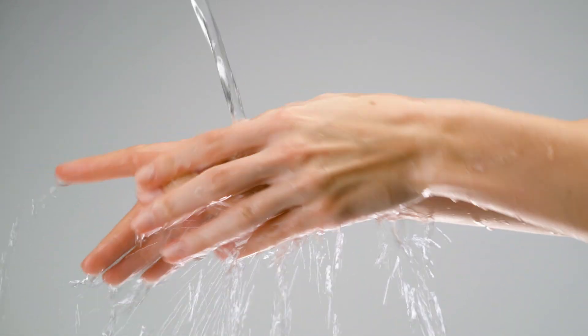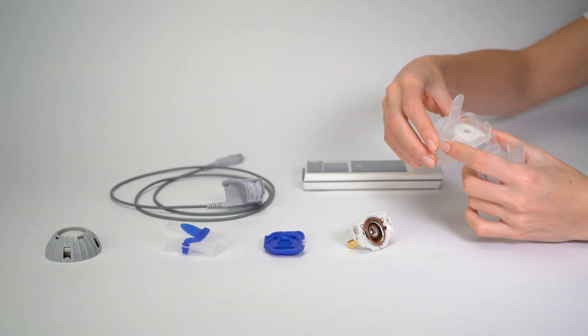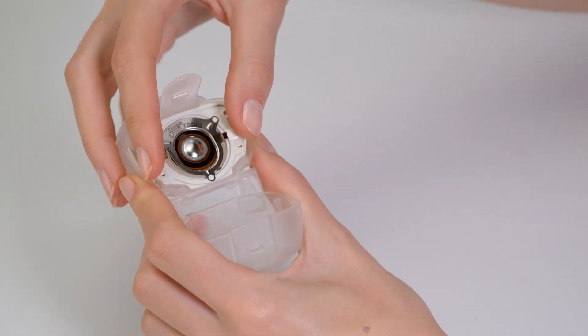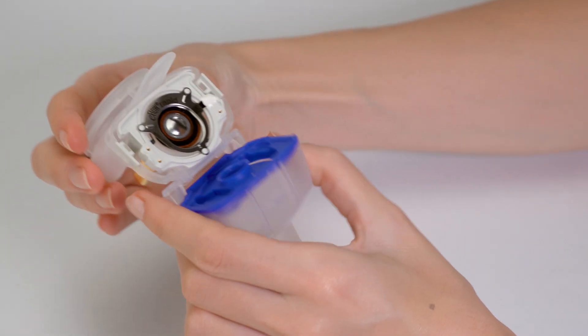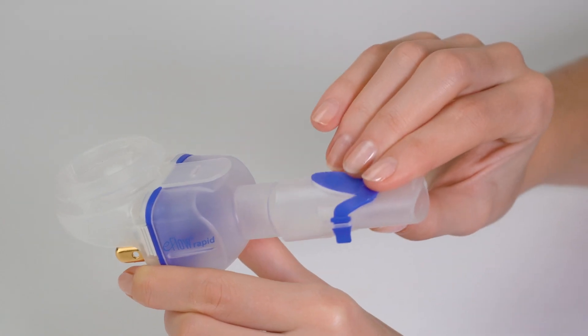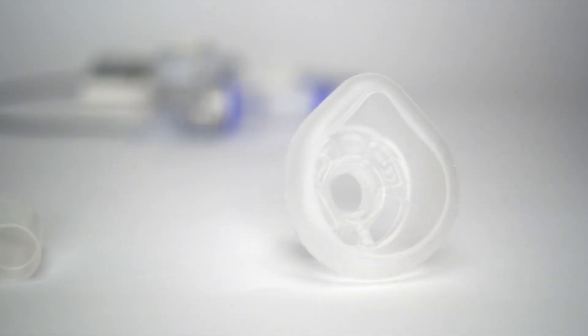Wash your hands thoroughly before each treatment session. Insert the aerosol head into the openings on the medication reservoir and place the inspiratory valve onto the aerosol chamber. Attach either the mouthpiece, the Smart Mask Baby with Bend, the Smart Mask Kids, or the Adult Smart Mask.